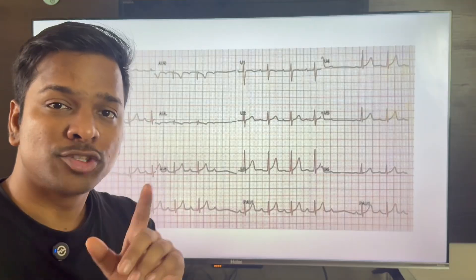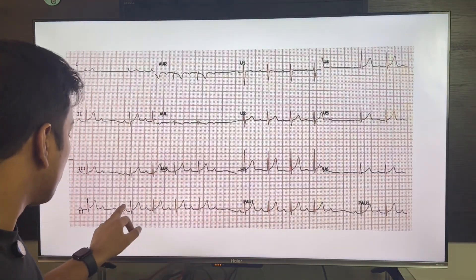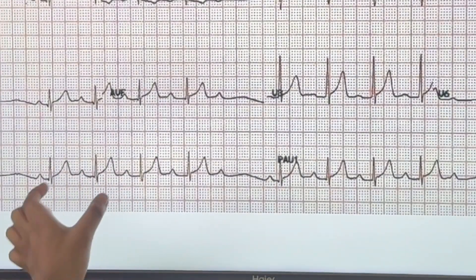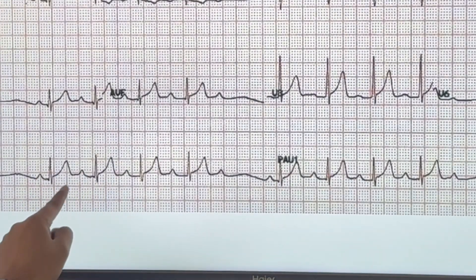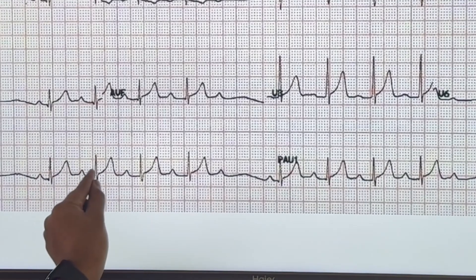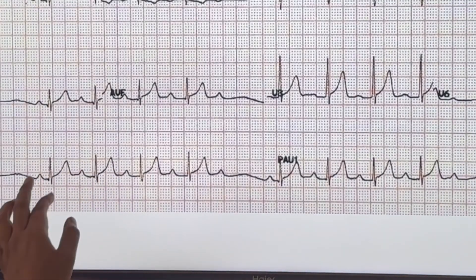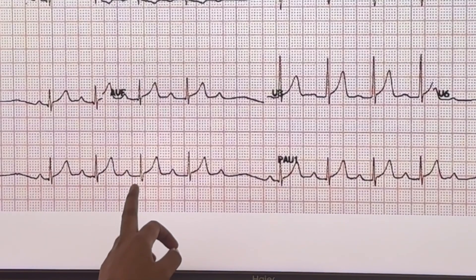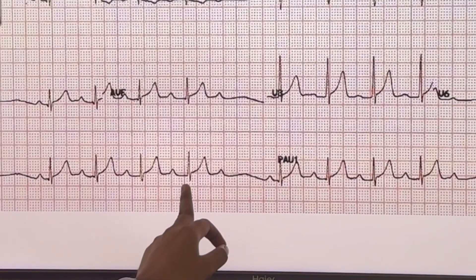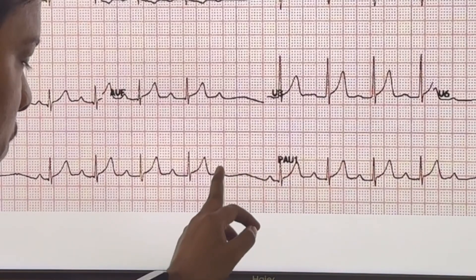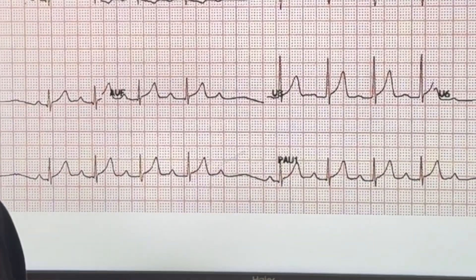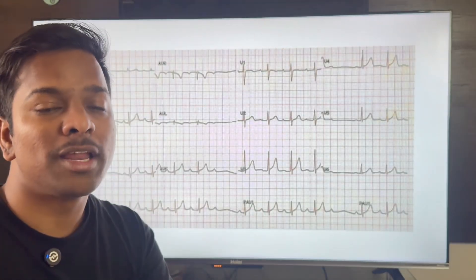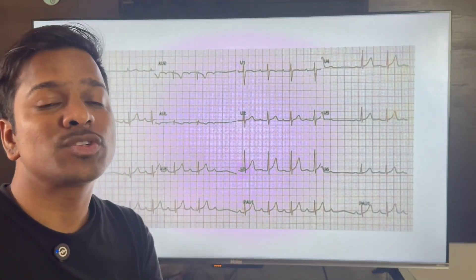The next ECG shows sinus rhythm with P and QRS present, but the PR interval is gradually getting prolonged — here we see three boxes, then four to five, then five to six, then seven boxes. After this, a P wave appears but is not followed by a QRS complex. This has to be second degree heart block, particularly Mobitz Type 1, also called the Wenckebach phenomenon.